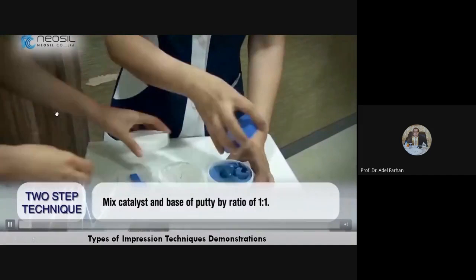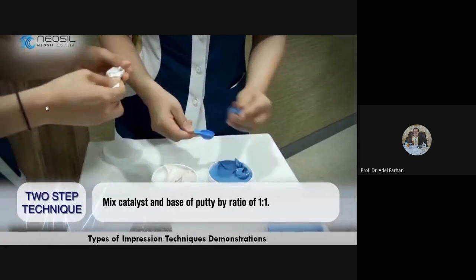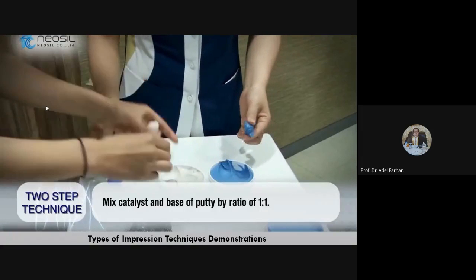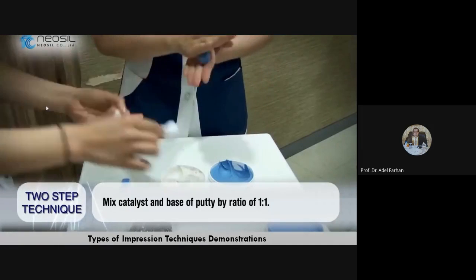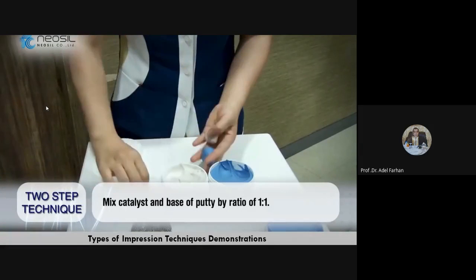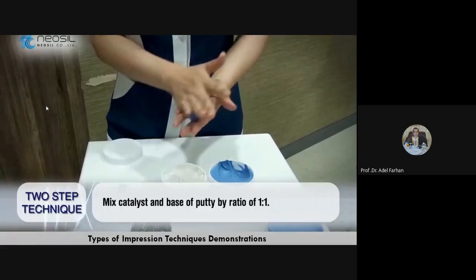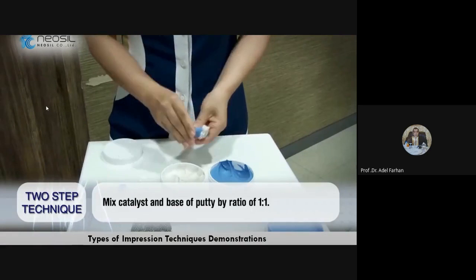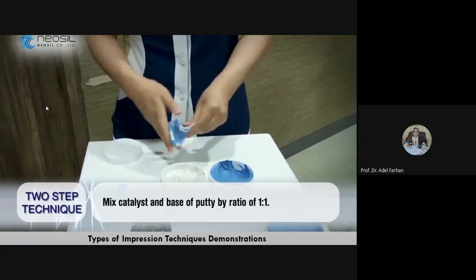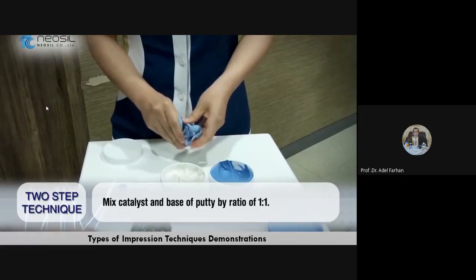طبعا مثل ما نشوف هذا الباتي viscosity. اوكي equal amount of base and catalyst by finger. طبعا هنا لما نستعمل السيليكون لازم ما نستعمل جلوفز، لان الجلوفز فيها لاتكس. اللاتكس جلوف going to inhibit السلفر، يسوي inhibition للpolymerization of the material. لذلك تشوفون الهاند of the assistant without gloves.